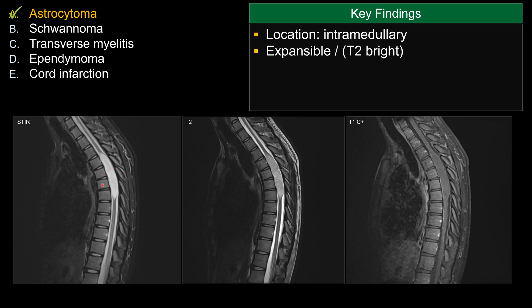This lesion is very expansile, so very much a mass-like lesion. In this particular case, you see no enhancement at all, which is actually quite uncommon for either astrocytoma or ependymoma. So this is a good case that in reality, sometimes a lesion does not follow the textbook description.